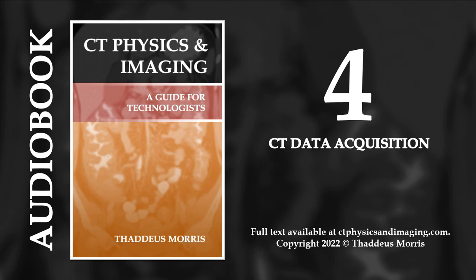Imaging axes. In CT, it's very important to think of the patient as a 3-dimensional object. That's because the patient is a 3-dimensional object and because the data created in CT includes all 3 dimensions. This is obviously different from general radiography, which produces 2-dimensional images where all of the anatomy is superimposed onto itself.